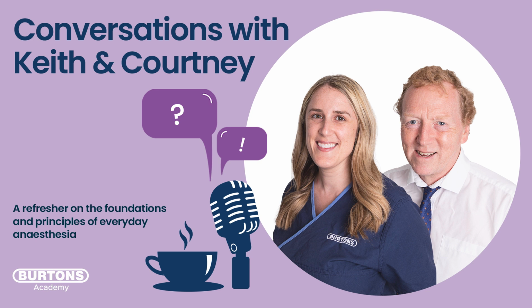And what we're doing in that time is we're pushing out all of the nitrogen that's in the room air there, filling it up with 100% or close to oxygen, as well as our volatile agent. And we have to have it at that nice high rate because of the volume of the system, and we need to ensure that we're pushing it all out. But also our patients' lungs are still full of this room air prior to being anesthetized.